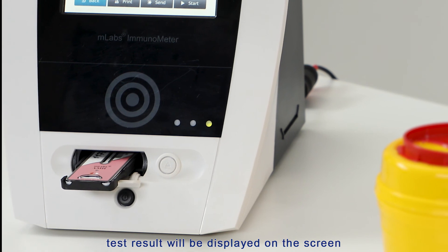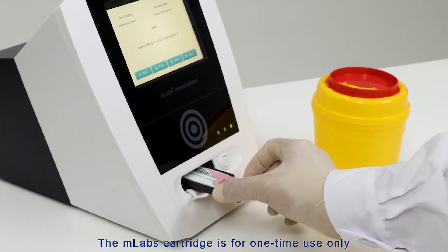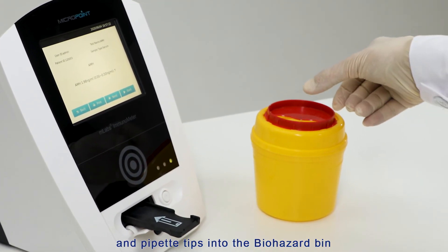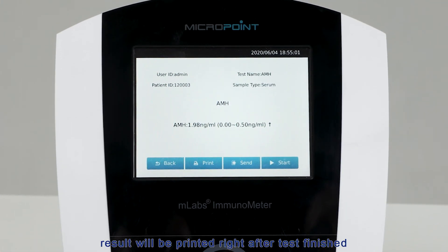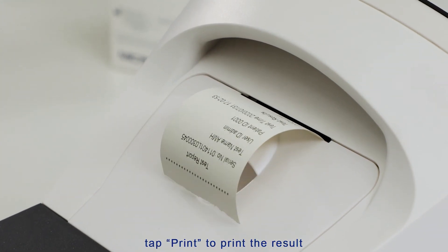When the test is completed, the cartridge is ejected automatically and the test result is displayed on the screen. The M-Labs cartridge is for one-time use only — discard used cartridges and pipette tips into the biohazard bin. For auto-print mode, the result will be printed right after the test finishes. If set to manual print mode, tap Print to print the result.